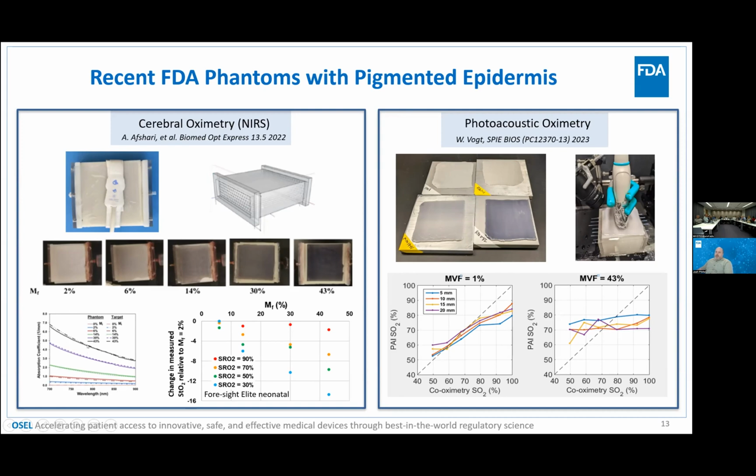for different skin tones. And then by measuring the saturation of blood injected into the phantom, we can look at how the simulated melanin volume fraction impacts the measured value. And you can see this negative bias as a function of increasing melanin content.